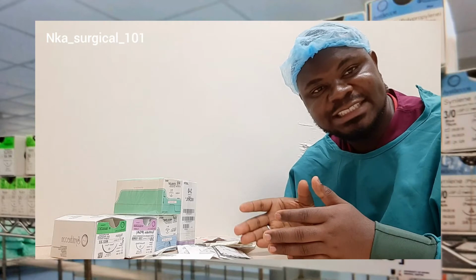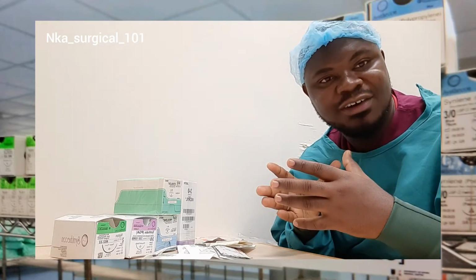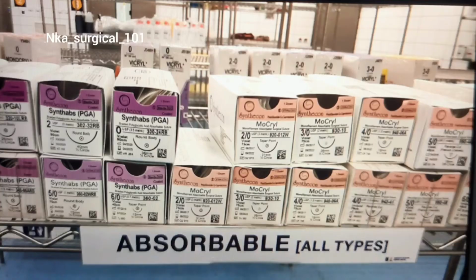And under each of them, we have the synthetic and we have the natural. So we have synthetic absorbable suture, natural absorbable suture, synthetic non-absorbable suture, and natural non-absorbable suture.